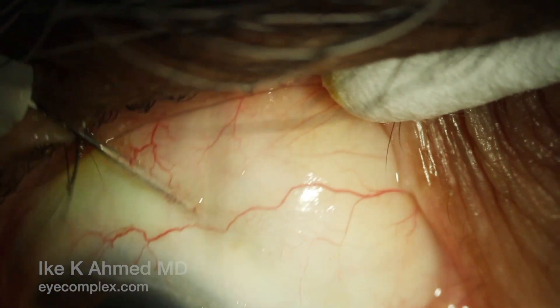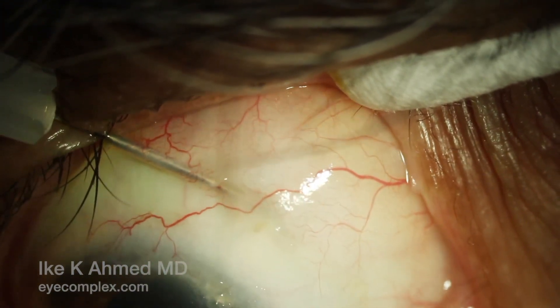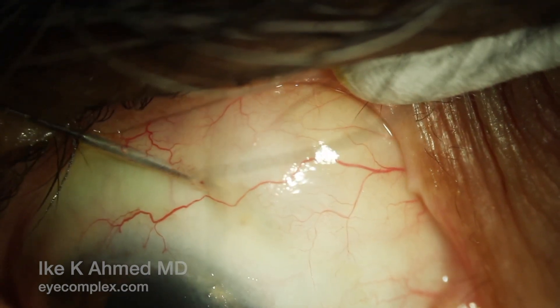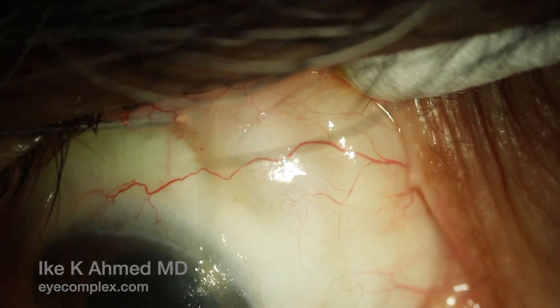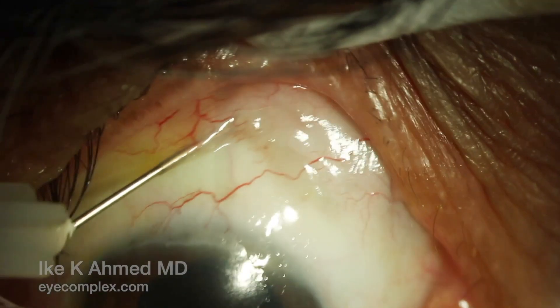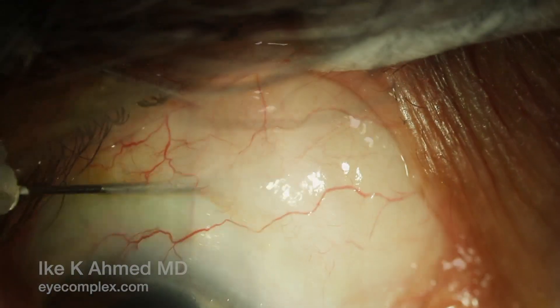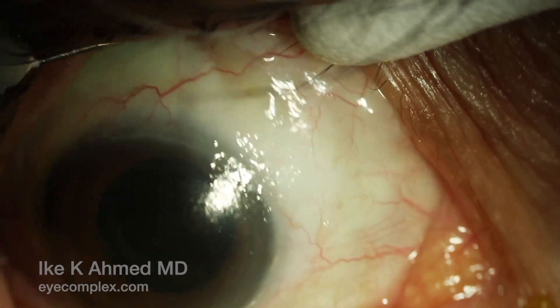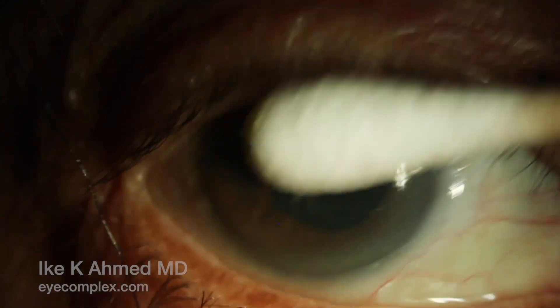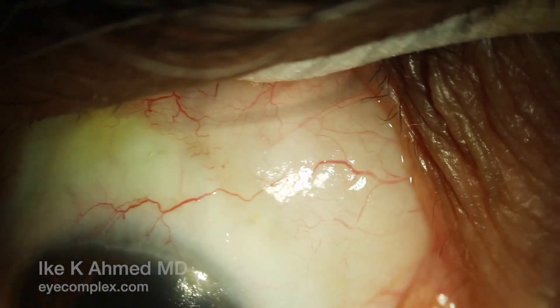Viscoelastic may be injected at this point to further separate tissue and retain the bleb for the first few days. Typically cohesive viscoelastic can be used, and along with an antifibrotic, this can be helpful to ensure good wound healing control. Post-operative topical steroids are used vigorously for the first few weeks to control inflammation. At the end of the needling, the pressure drops typically to the single digits and the bleb is nicely well-formed.